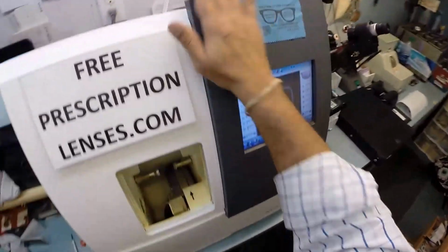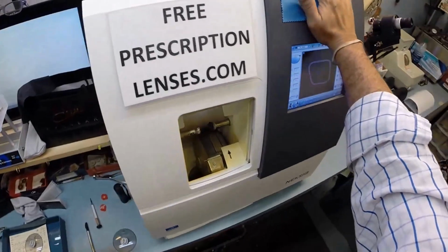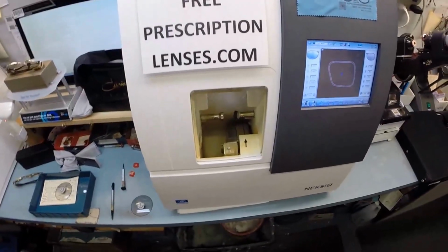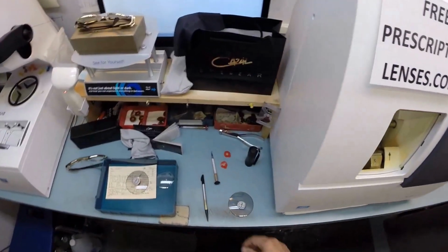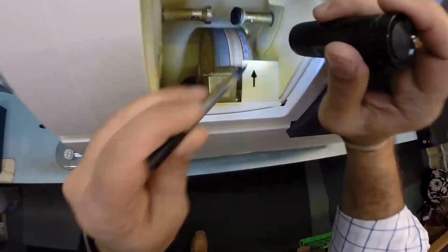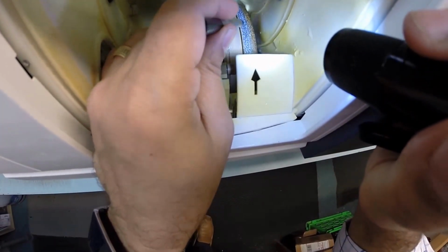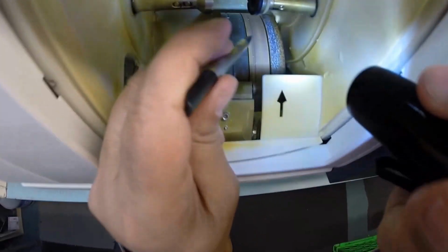Now this is the edger. This is what's going to do the work tonight. This is what costs $40,000. It weighs 200 pounds. I recommend everyone go out, buy their own, put it on your kitchen counter. Then you can cut your own lenses at home and you won't need this guy to do it for you anymore. But the actual cutting wheel is over here on the far right. It's got that white powdery residue on there. I don't know what that is. Hey, I shouldn't even joke about that.